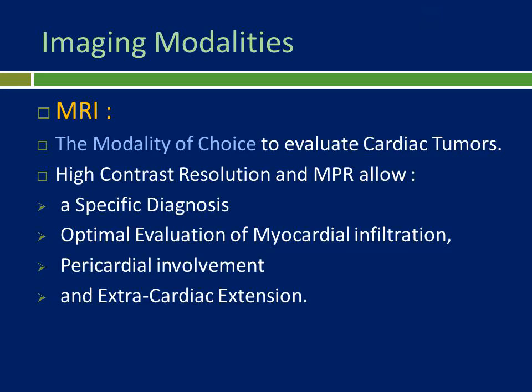Imaging modalities: MRI. The modality of choice to evaluate cardiac tumors. High contrast resolution and MPR allow a specific diagnosis. Optimal evaluation of myocardial infiltration, pericardial involvement, and extracardiac extension.